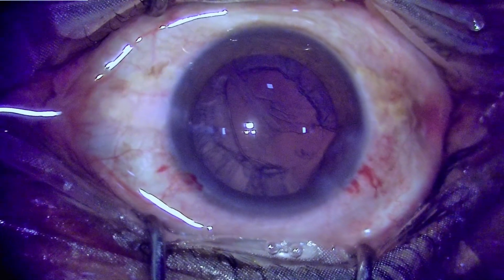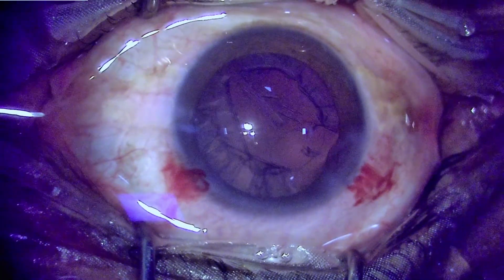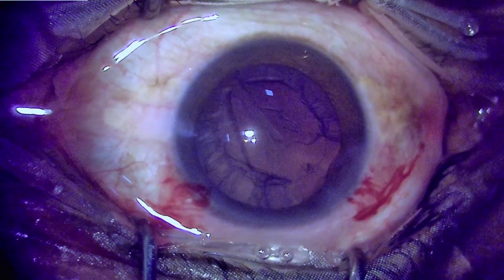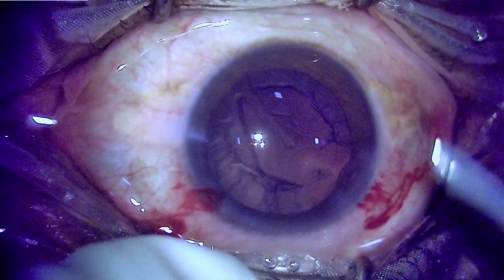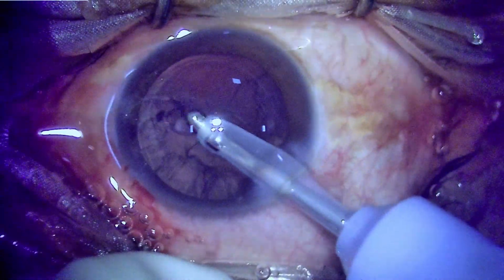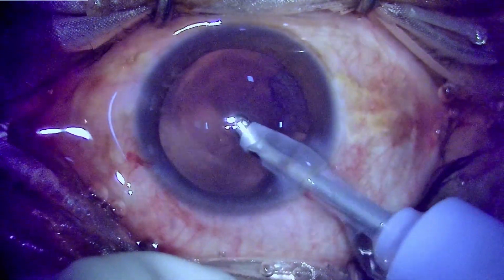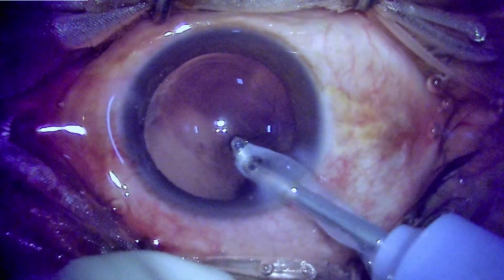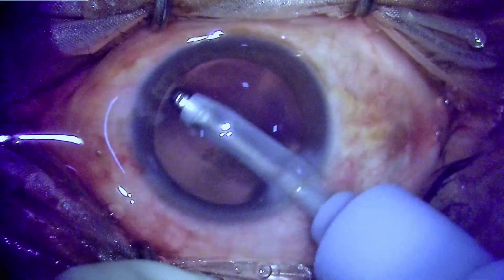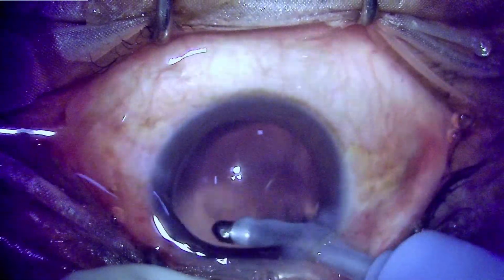The retroillumination here is providing a good amount of clarity and view, and the patient is also not bothered by the intensity of the light, being a slightly more apprehensive kind of patient. So this is one solution for these kinds of patients who have too much reflex blepharospasm and have difficulty fixing on the bright light of the microscope. The view is very clear because the retroillumination provides a very discerning view of the refractile fibers of the lens, especially in immature cataracts.